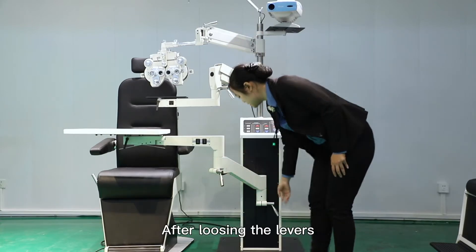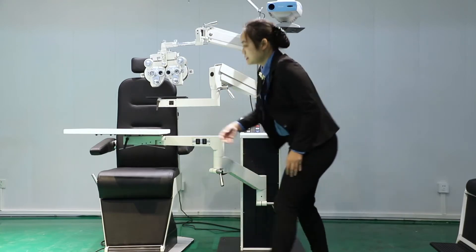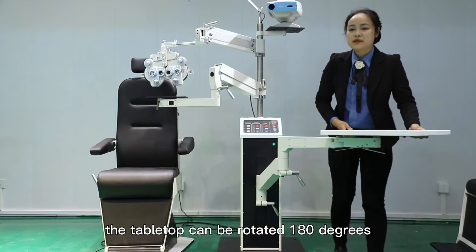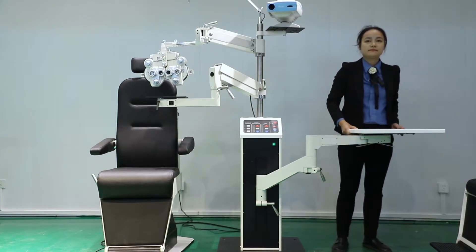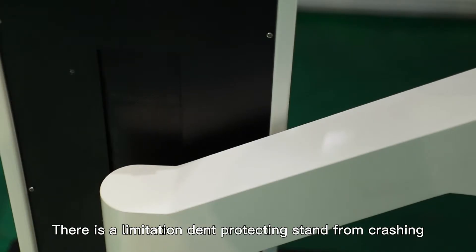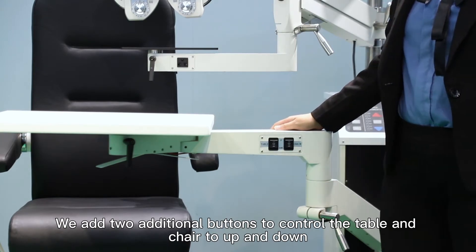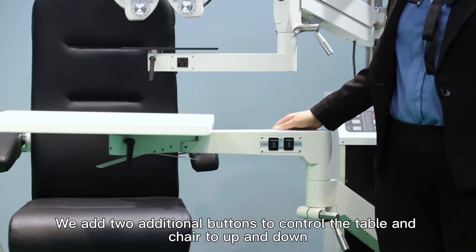After loosening the levers, the table can be rotated 180 degrees. There is a limitation to protect the stand from crashing. We also added two additional buttons to control the table and chair up and down.